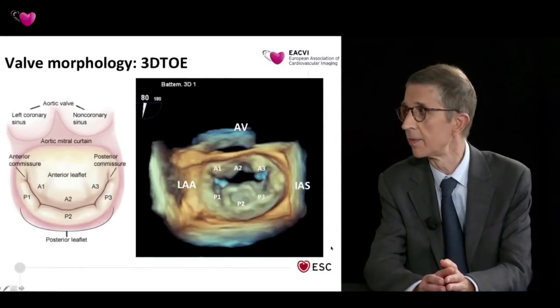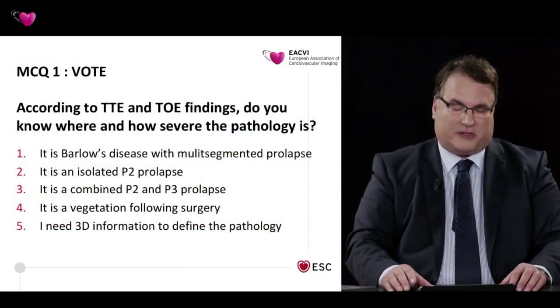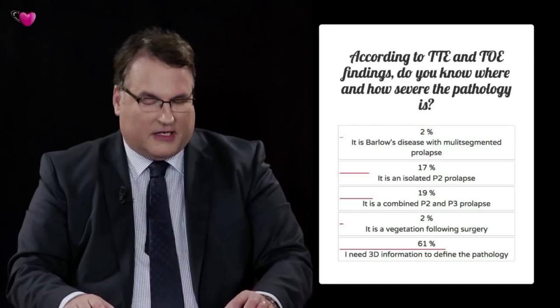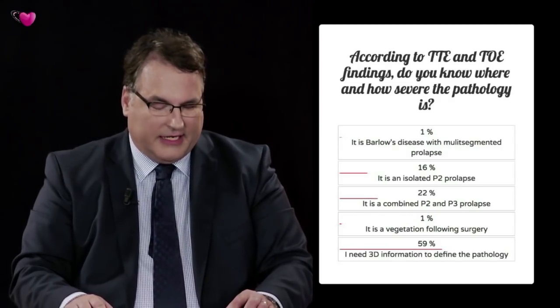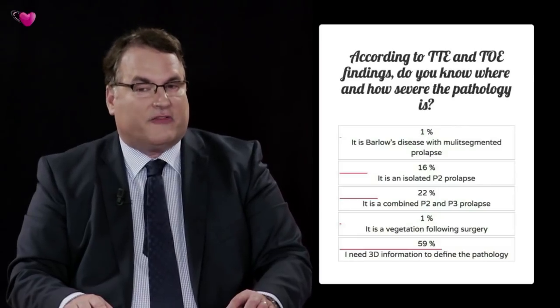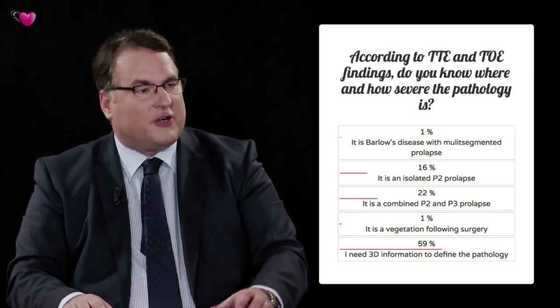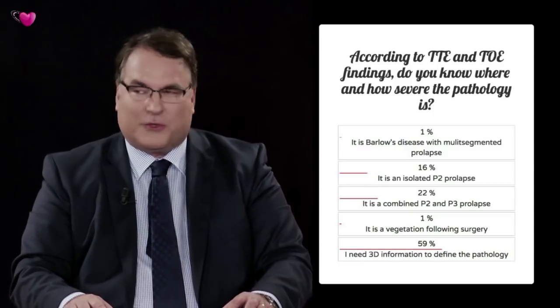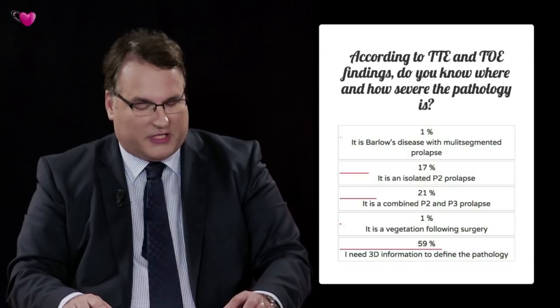Maybe we can see the vote also. The vote is very interesting, and I think the participants are actively thinking with us. The most predominant answer, the leading answer at 59%, is that they need 3D information to definitely define the pathology. Looking back, since I've been doing webinars and using 3D matrix probes in 2007, which is now 11 years ago, this answer has completely changed over time.